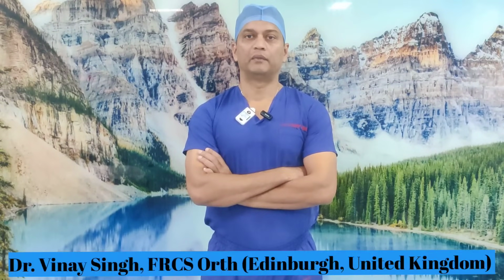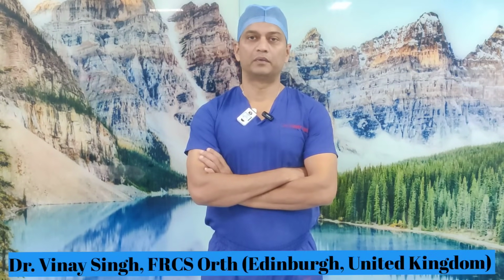Hello viewers, today I am going to show you a surgical approach which involves fixing a medial tibial plateau fracture with a medial approach. Now the two common approaches that are used are medial or posteromedial approach. So today I am going to take you through a medial approach for a patient who has got a medial condyle fracture, and I'll take you in a step-by-step fashion as how to do this approach.